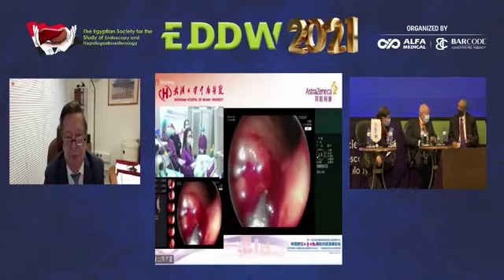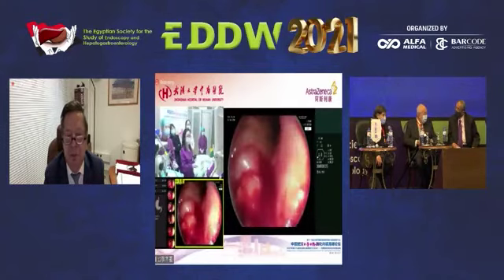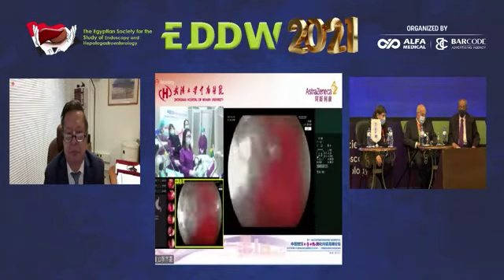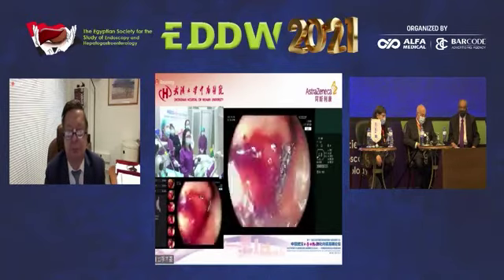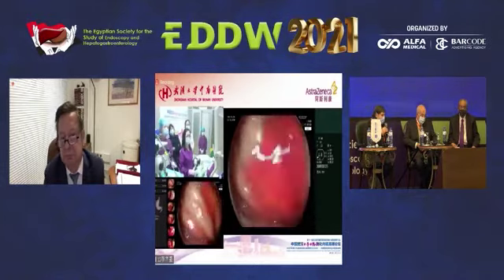And I think after we took the biopsy, we think the lesion is malignant because we can see the mucosa is very stiff, not soft as usual. Perfect. Yes, you are totally right. It's well demonstrated. So the whole lesion looks stiff, not soft, when we absorb the air.